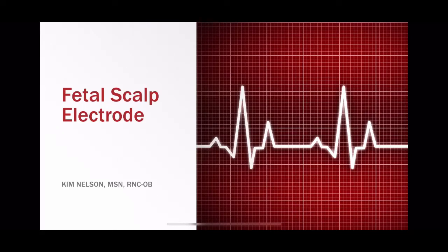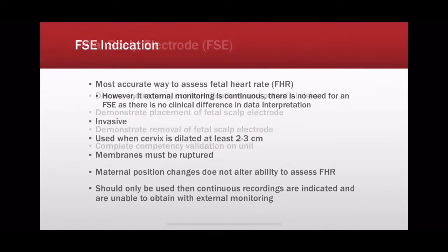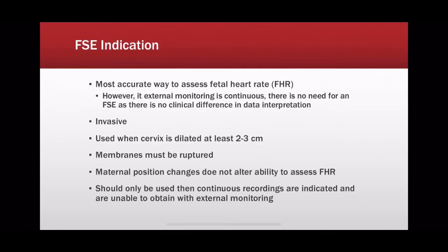Good morning, I'm Kim Nelson and I am going to be doing a presentation on fetal scalp electrode. We're going to go ahead and discuss the indications, contraindications, and potential risks. We're going to demonstrate the placement of an FSE and the removal of an FSE, and I'll go over how to complete the competency validation on your unit. So let's start with the indications.